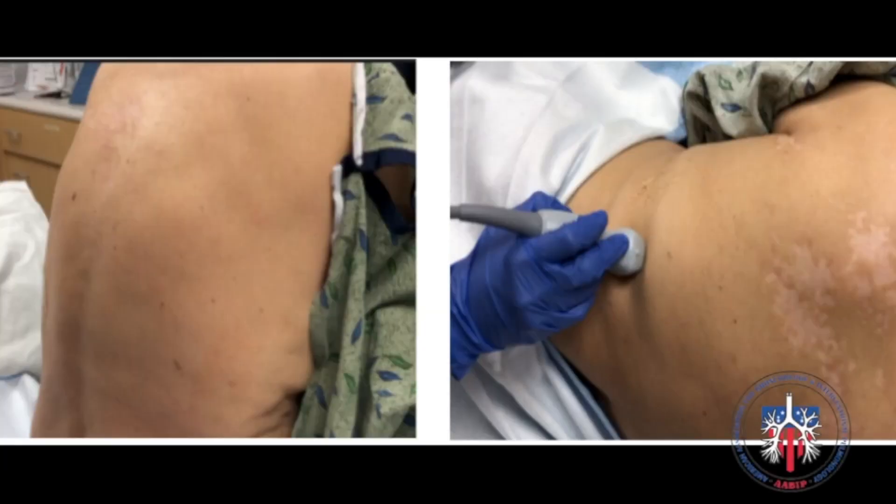This procedure is best done with the patient sitting upright and leaning forward with arms supported. The patient could also be in a recumbent position.